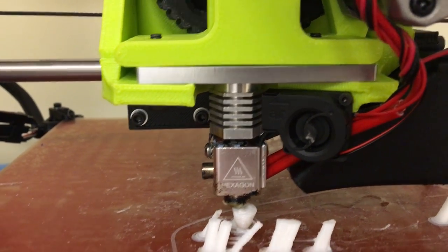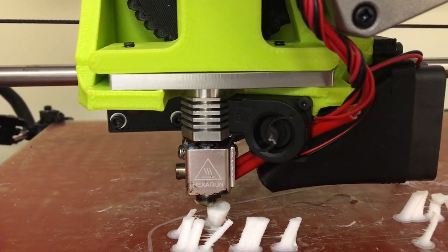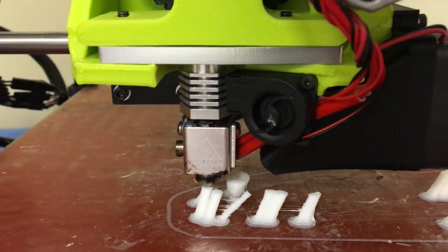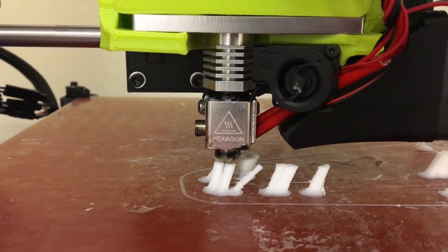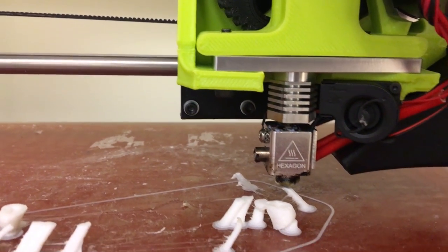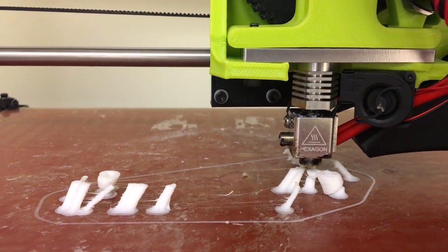There you can see the lower tip of the right lower bronchus, I think. And then there's the left. As you can see with NinjaFlex, it comes out very slowly just because of the way the material handles itself. But we'll see how this particular model turns out in a couple of hours.